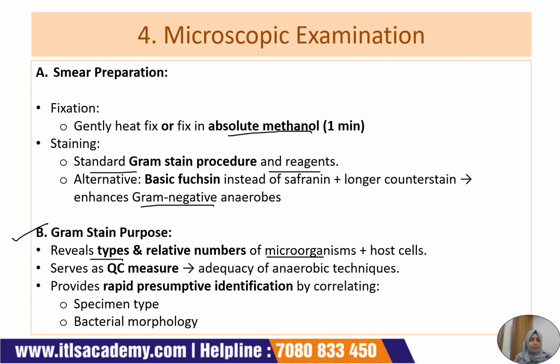Now, the gram stain serves as a QC, quality check, measure. It provides results that inform us about the adequacy of anaerobic techniques. It also provides rapid presumptive identification by correlation of specimen type and bacterial morphology.